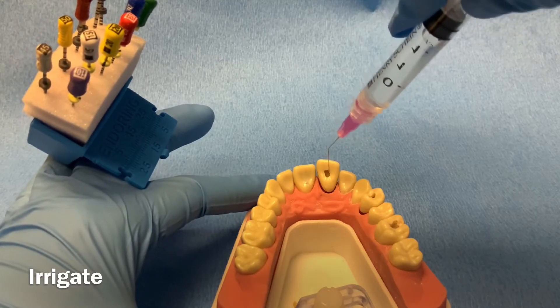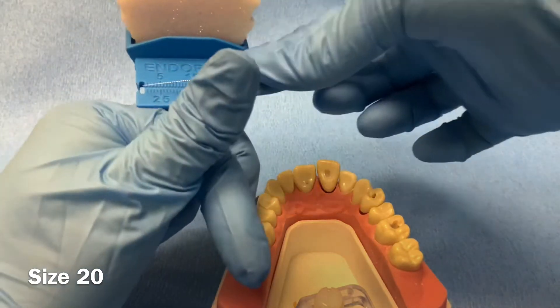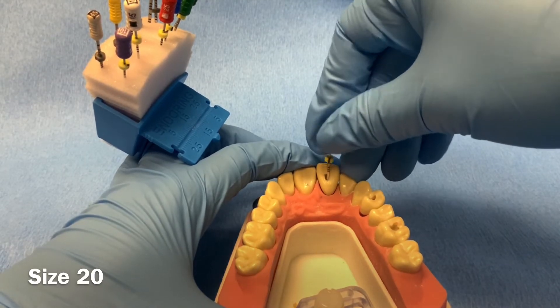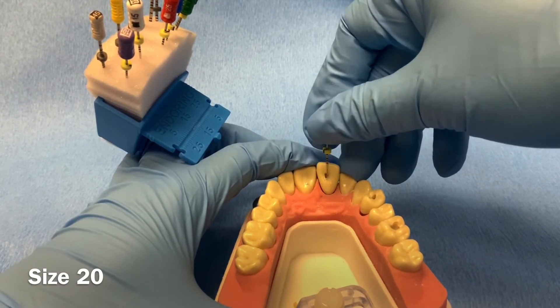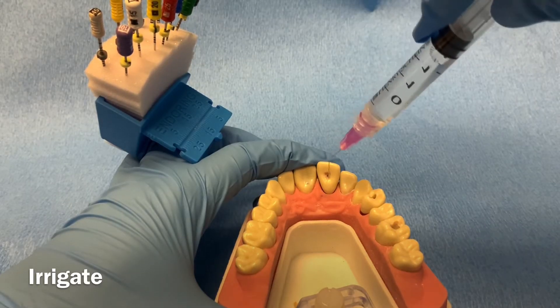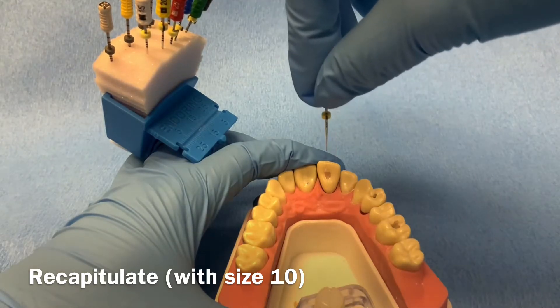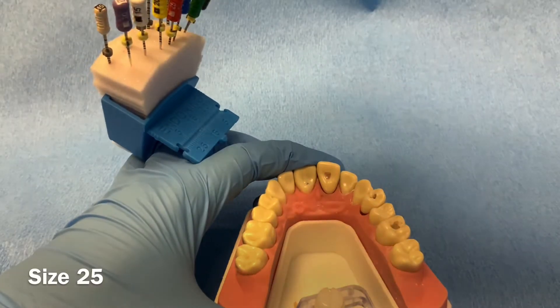Irrigate the canal once again and then repeat the process using the next larger size file, size 20. Irrigate and recapitulate using the size 10 k-file, which should go to working length. This is done intermittently along with irrigation in order to remove bits of debris packed at the apex, ensuring total canal debridement.